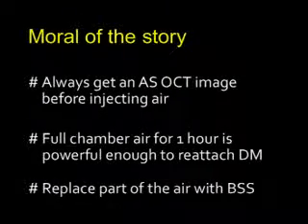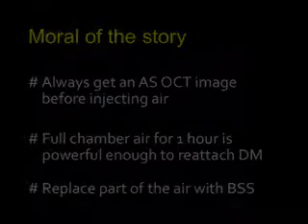Moral of the story: always get an anterior segment OCT before injecting air. Full chamber air for 1 hour is very powerful to reattach the DM. Replace part of the air with BSS.